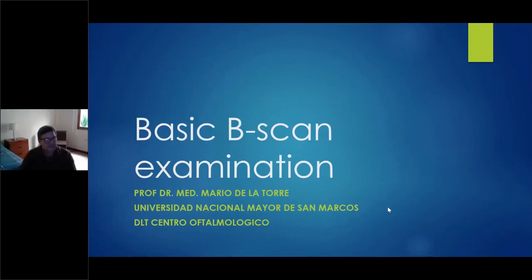And I would like to present this lecture talking about the basic B-scan examination, how you can conduct a basic B-scan examination, and you can take advantage for your machine, your presentations, your images, and especially if you have the right instrument. I mean, if you have the right ultrasound device, you can get better images. It's good for your patient and also good for your colleagues.